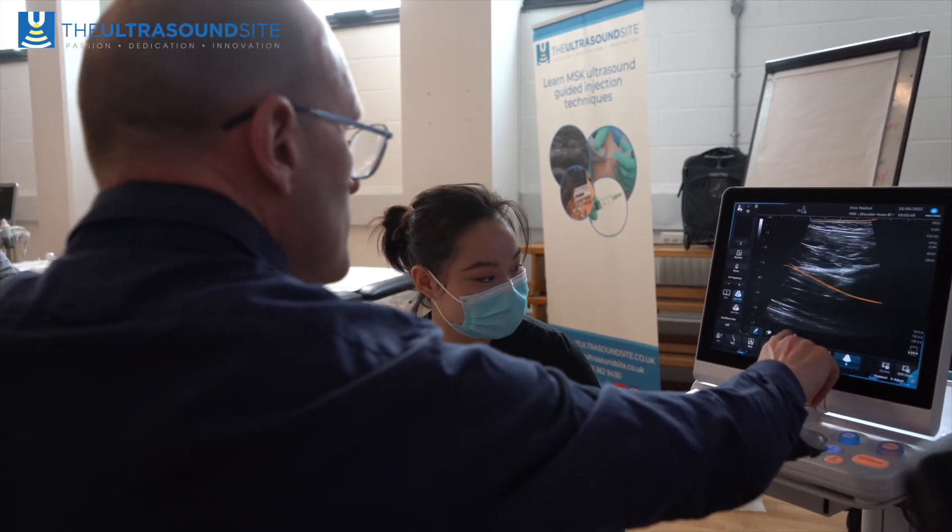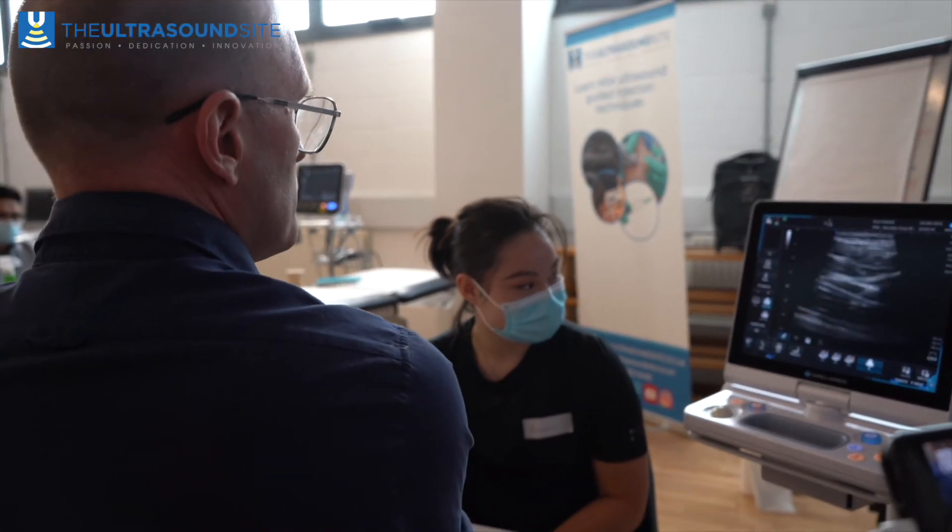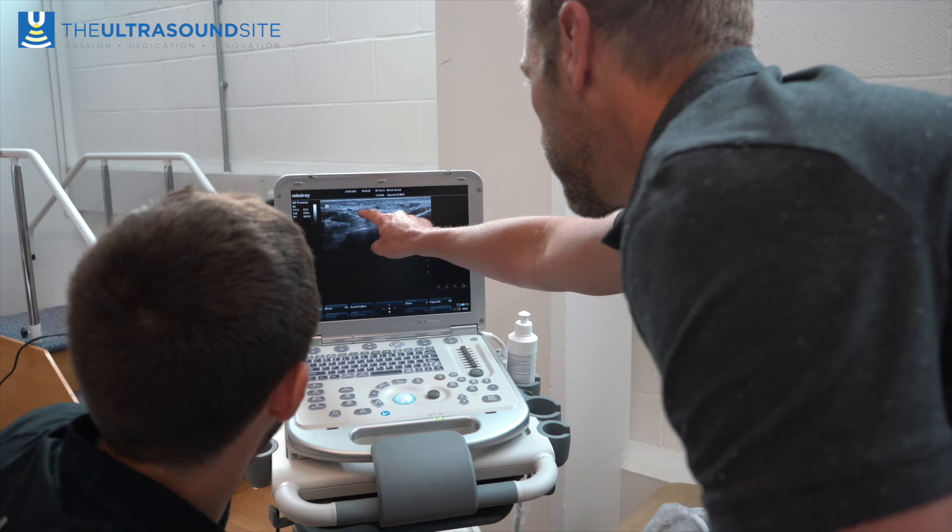This course is particularly suited for people who are new to MSK ultrasound. What we really try to get across is how to optimize the image. It is very difficult for people, particularly if they're new to ultrasound, to even see the anatomical structures properly on ultrasound, so we teach you the physics principles that allow you to get that image as clear as possible.